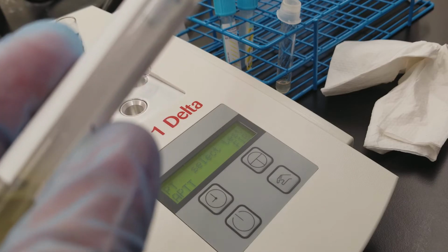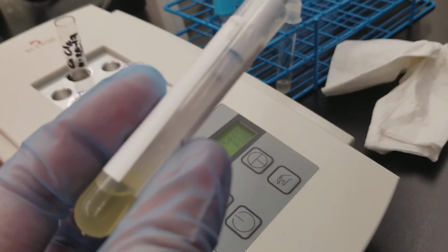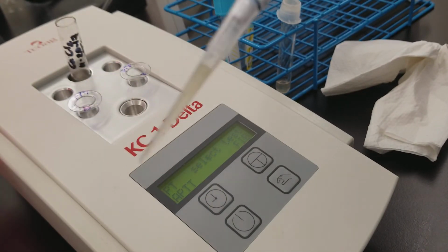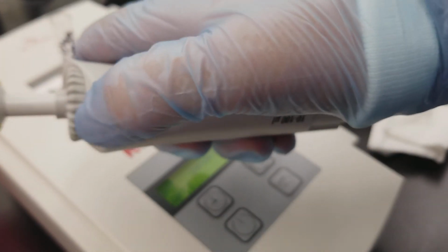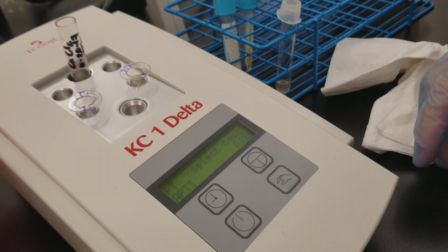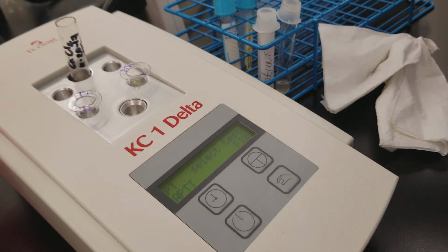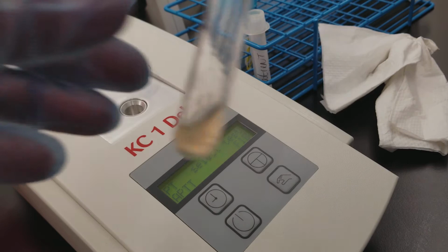Can you see it? Oh my goodness, come on, camera. I'm depressing in order to pull it up. Okay, so I have 100 microliters in there, and this is patient 8. We don't want to put it in the wrong one. So I put it in there, and then I'm going to get rid of it by pressing this to eject the tip.